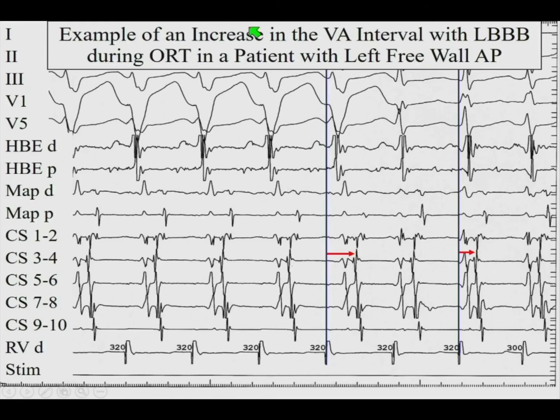Speaking of real life, a question came up: you're saying, well, obviously that's the His, and people are like, huh? I don't think I said obviously. How do I know if that's not the His, or that's not the His? How are you deciding here which one is the His? All right. Well, it's not a great example, I will give you that. That wasn't my point. And I didn't put the catheters in. This was a pediatric case. But how do you know what's the His?